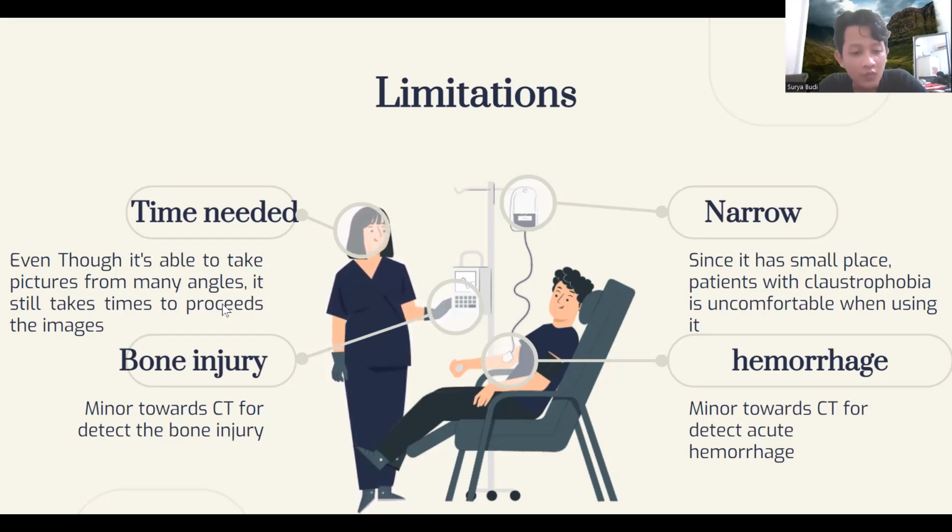And then for bone injury, MRI is inferior to the CT scan for detecting bone injury. And the MRI machine right now also has a narrow bore. So for patients who have claustrophobia or a phobia of small spaces, they might feel uncomfortable with this.